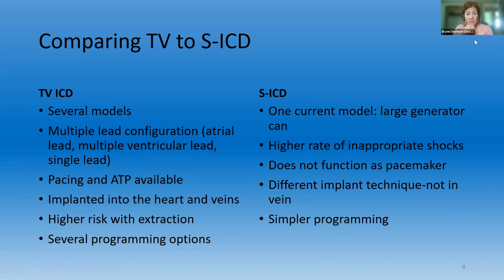You can pace with these types of devices, so that's important for some patients who need pacing. In addition, you can use anti-tachycardia pacing. So if patients have a rhythm that is amenable to a faster paced beat to get them out of it, the Transvenous ICD has this option.